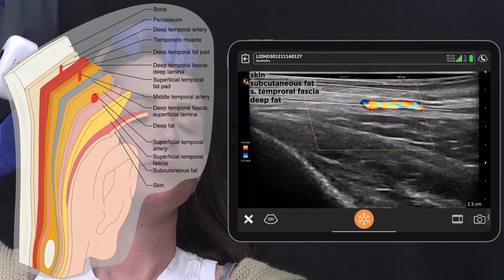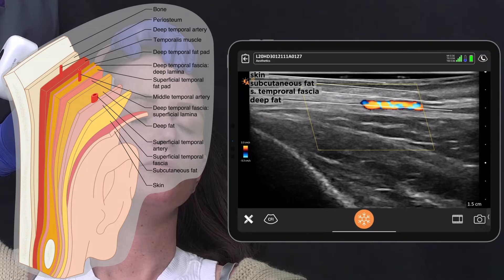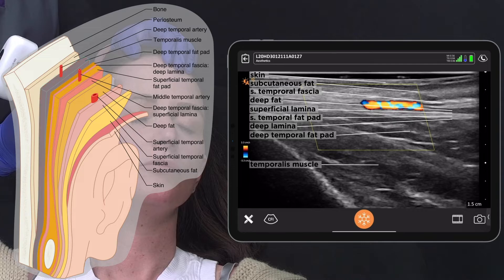Under this is the deep temporal fascia. Placement between the two fascia layers is why this technique is called the interfascial technique. The deep temporal fascia is split into two laminae, termed superficial and deep, between which lies the superficial temporal fat pad. Under the deep lamina of the deep temporal fascia lies the deep temporal fat pad, followed by the temporalis muscle, and finally periosteum and bone.